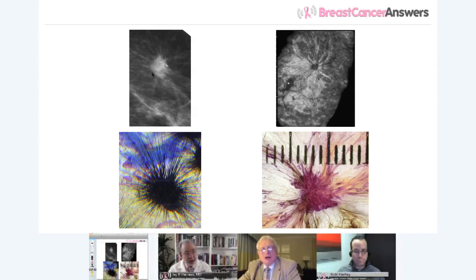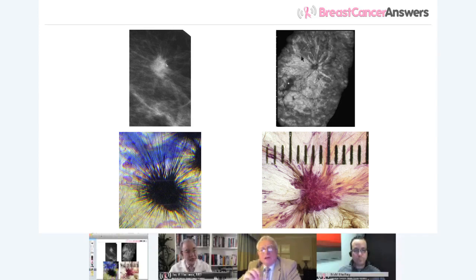The next slide shows how the normal structure is distended and distorted. You see a star-shaped tumor on the left side — that's the mammogram of a screen-detected, non-palpable cancer. On the right side we see the ultrasound image, not conventional but this new upcoming three-dimensional ultrasound image, and you see the radiating structure of the cancer in black and white. There it is: a five-millimeter carcinoma detected on the mammogram — tiny, small, totally curable by Dr. Harness, the surgeon.